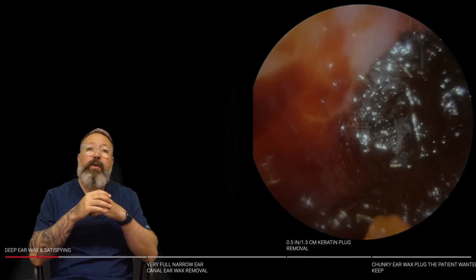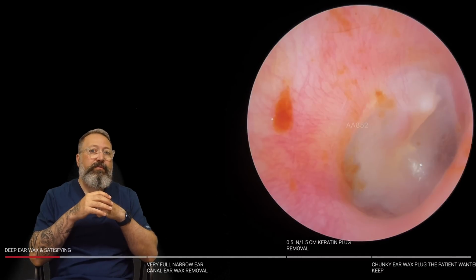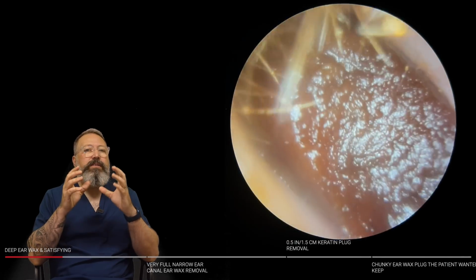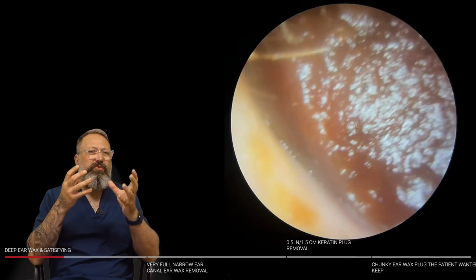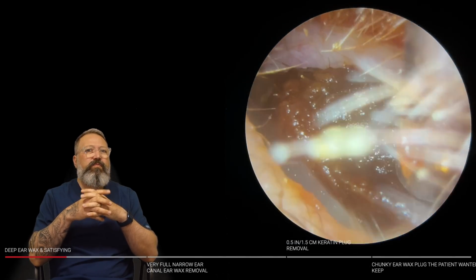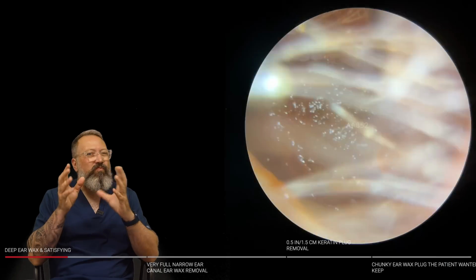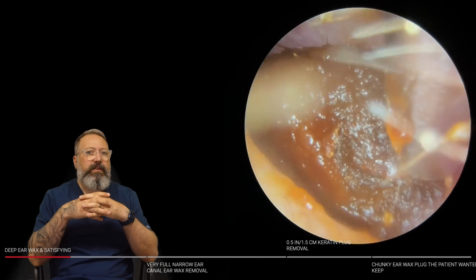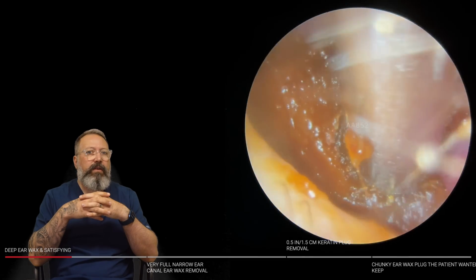So this is what it looked like beforehand, and this is what it looks like afterwards. Let's take a look at the other ear canal. Similar story, but it's more towards the outer part of the ear canal. This just looks like a standard kind of plug. A little bit of a gap at the top, so patient not really experiencing any hearing issues at this point. But we're just going to give this a little bit of a wiggle here.